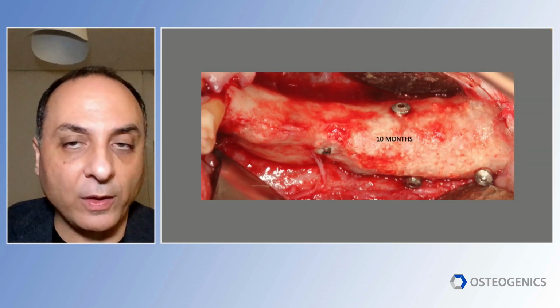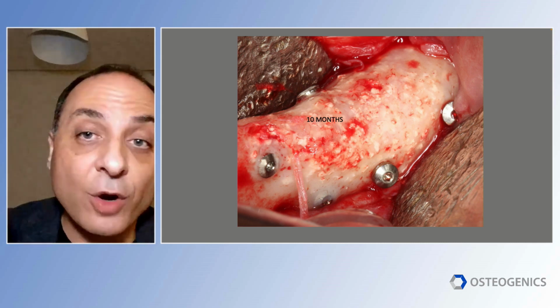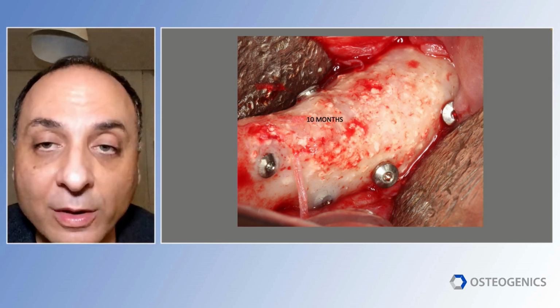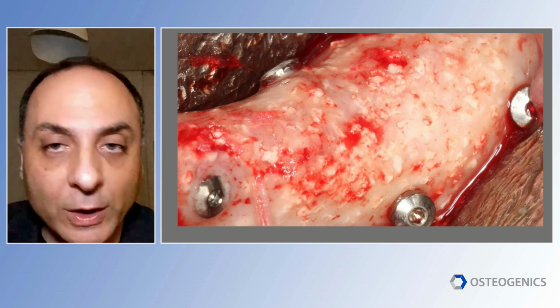And look at the outcome. This is at 10 months. In this case, unintentionally, the patient was left at 10 months because he was away, but I invite you to have a look at the healing. So this is something beautiful, beautiful. Close-up view, look at that. So everything is completely corticalized.